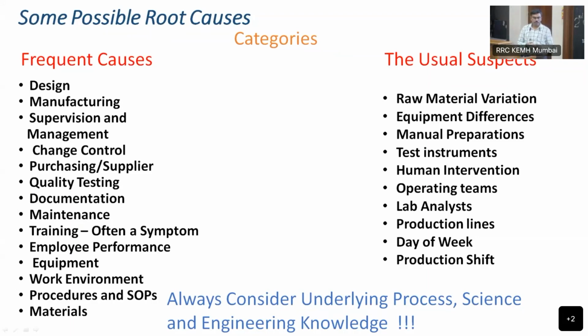So 1:2 is recommended, but I did not write it in the SOP. So any technician has got the right to do any dilution at his own will. He will happily do anything. So what happens is that when procedure is not defined, documentation is not there, then our technician follows the procedure at will.